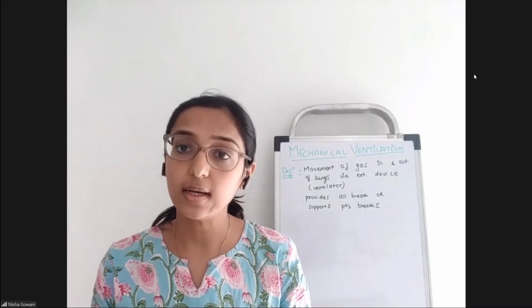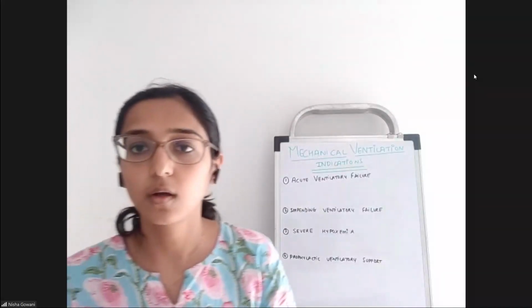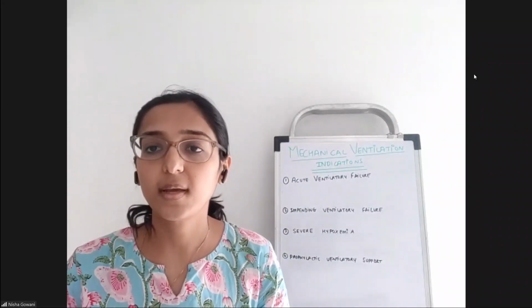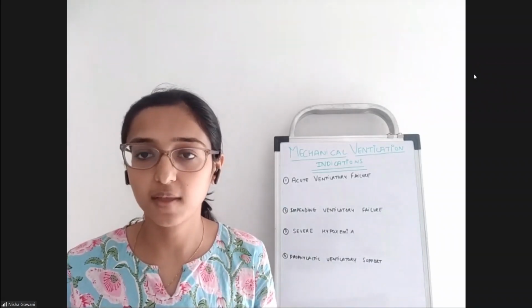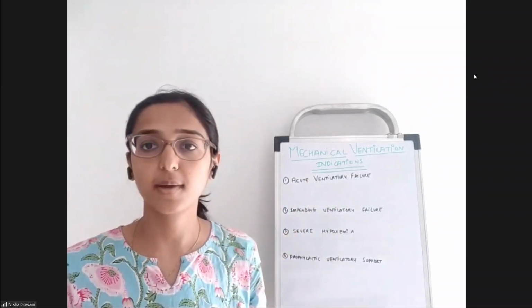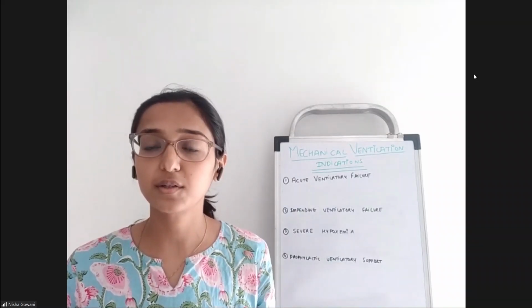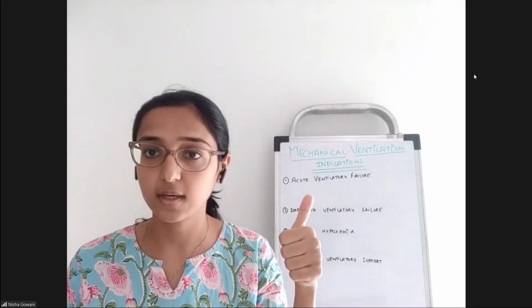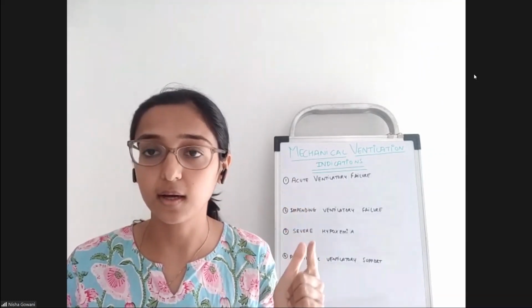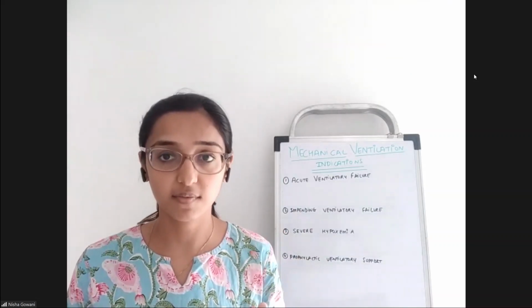Now we shall go through the indications for mechanical ventilation. So I've enlisted four main indications for mechanical ventilation. So let's go through each of them one by one. The very first that I mentioned is acute ventilatory failure. A patient is said to be in acute ventilatory failure when he's gone into complete apnea. So apnea is one of the indications. The second is bradypnea. That is when the respiratory rate of the patient has reduced severely.